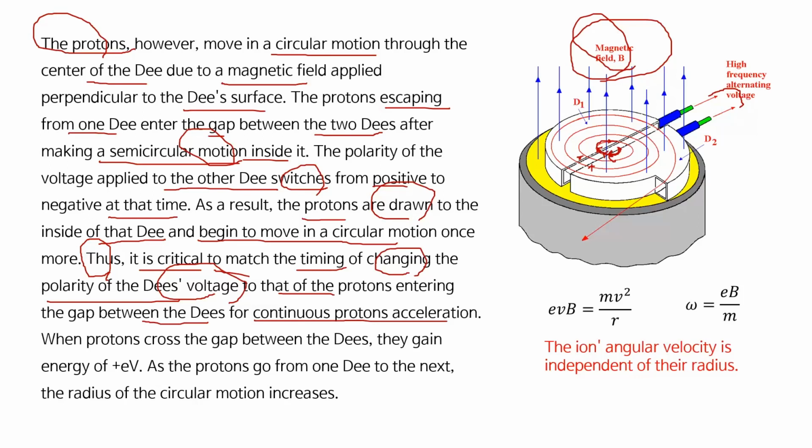So we have to match the time of changing polarity for the proton to accelerate by this high voltage.